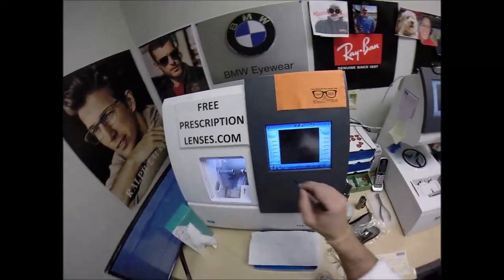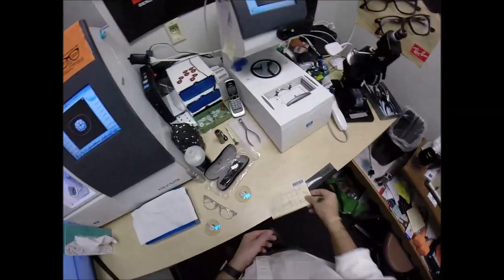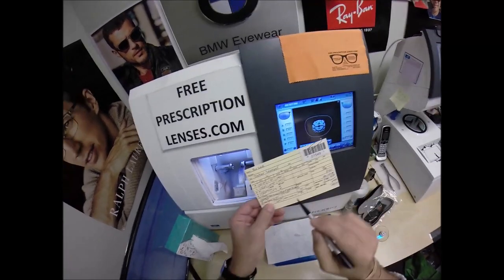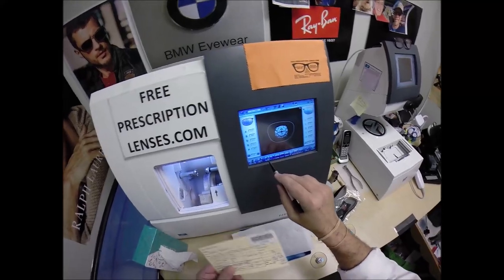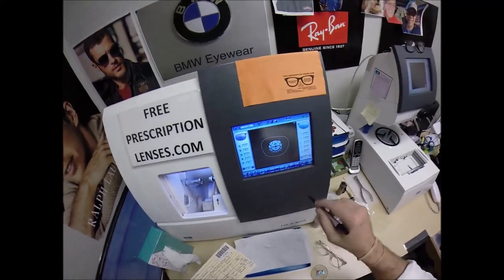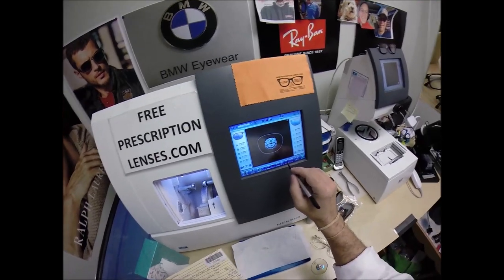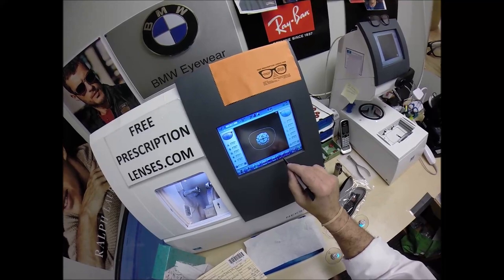Let's wake up the computer. This is job number 1549. These are polycarbonate lenses. If they were plastic, high-index plastic, or Trivex, I would select that. But those who have seen my videos know I love me some polycarb because it's thinner, lighter weight, unbreakable, durable, and has 100% UVA and UVB protection.